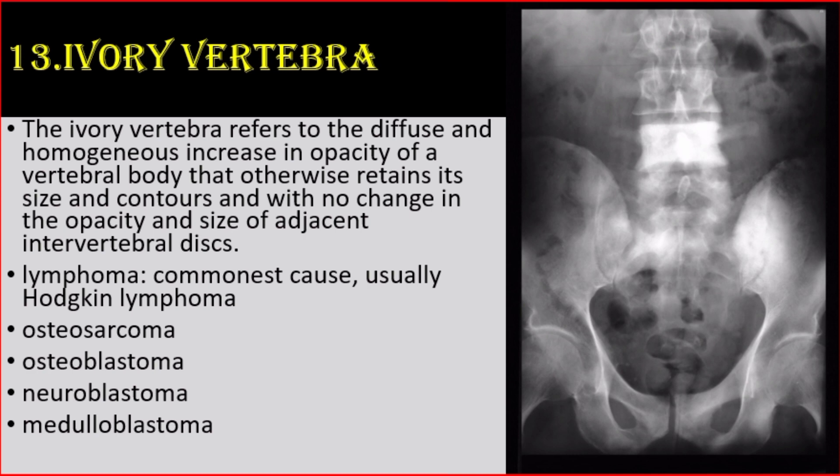Number 13: Ivory vertebra. The ivory vertebra refers to the diffuse and homogenous increase in opacity of a vertebral body that otherwise retains its size and contours, with no change in the opacity and size of adjacent intervertebral discs. It can be seen in lymphoma — most commonly Hodgkin lymphoma — and also in osteosarcoma, osteoblastoma, neuroblastoma, and medulloblastoma.